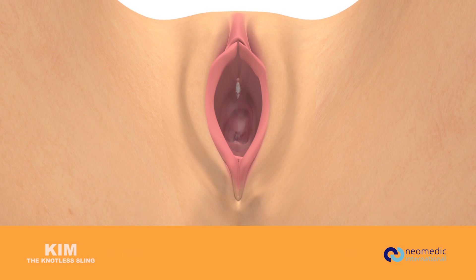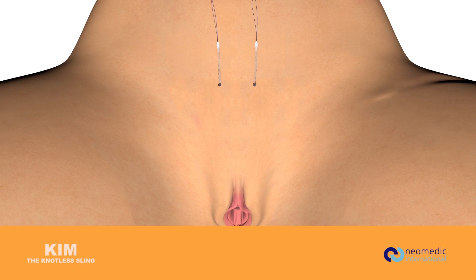Close the vaginal incision and cut the excess of sling at skin level.